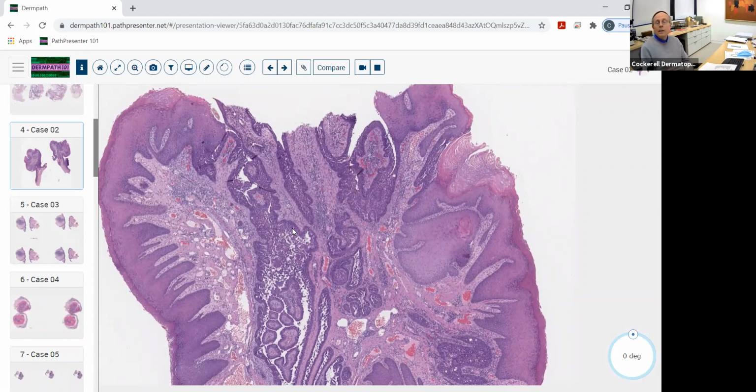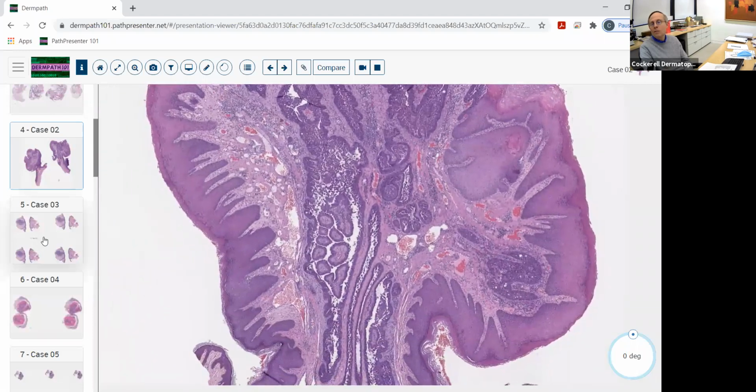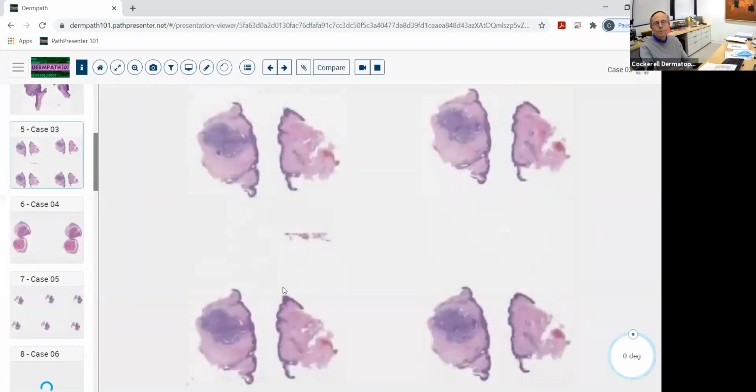Okay. And another name, if you want to get into esoteric, arcane information, these used to be called Werther's nevus, W-E-R-T-H-E-R, years ago. So that's just another name for this lesion, and the vast majority of these we see are seen in association with nevus sebaceous. So warty lesion, apocrine differentiation, exophytic architecture, contiguous to the epidermis: syringocystadenoma papilliferum.